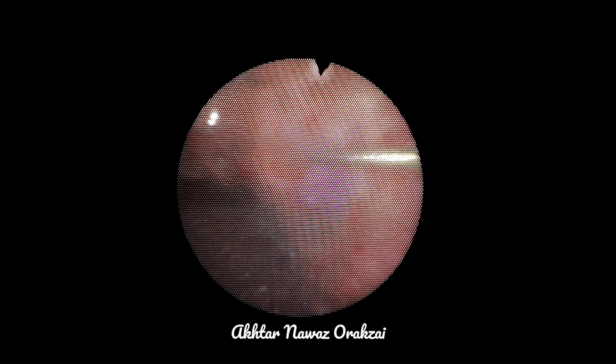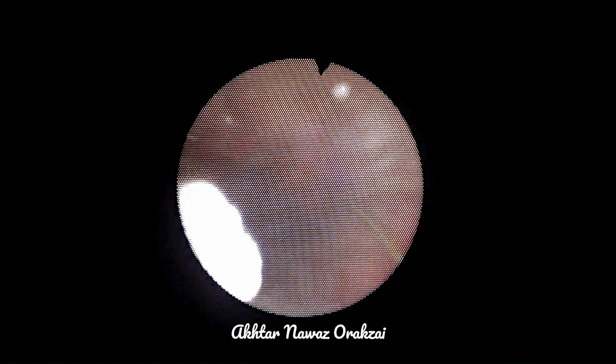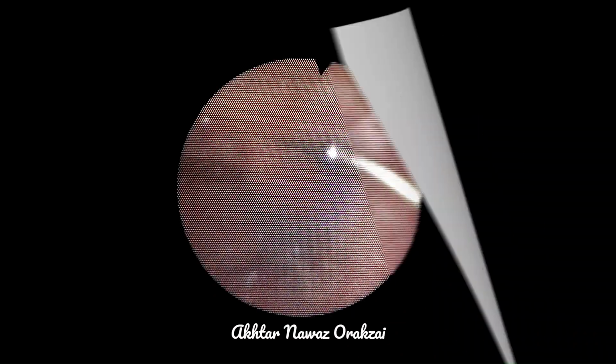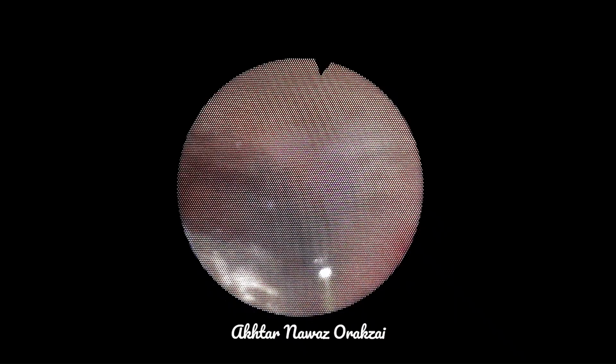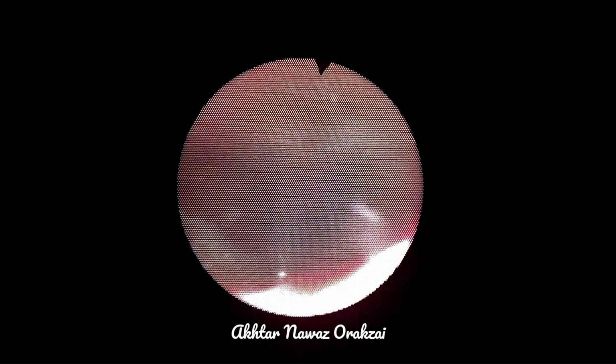We remove the needle, and then we place a fascial dilator of 6 FR to dilate the tract a bit, and over that we place an olive tip dilator of the same Alken's dilators that are used for percutaneous nephrolithotomy. It is a serial dilatation and telescoping of the dilators one after the other. So slowly and gradually the increasing sizes of dilators are passed.